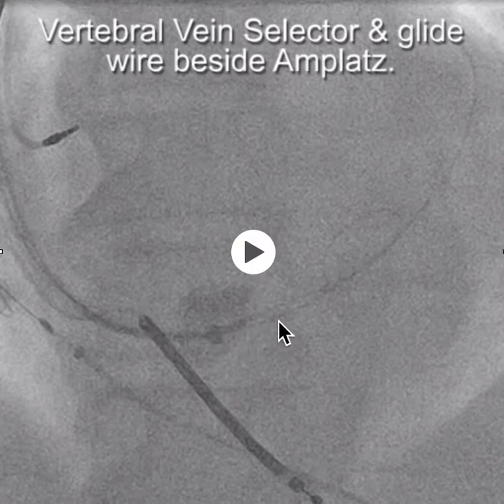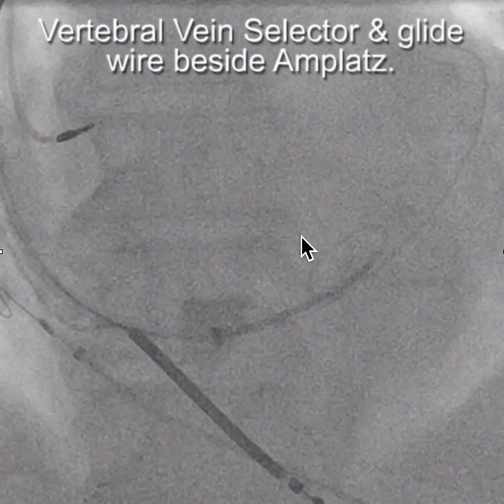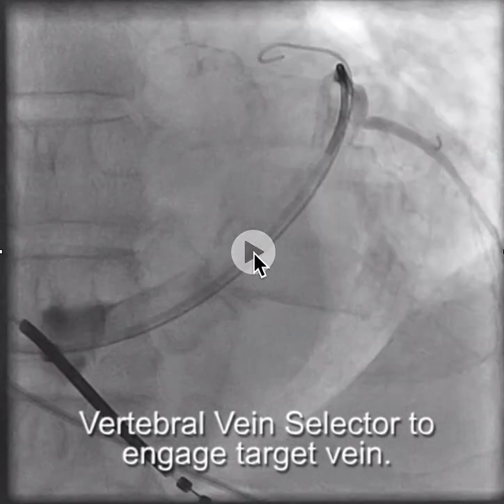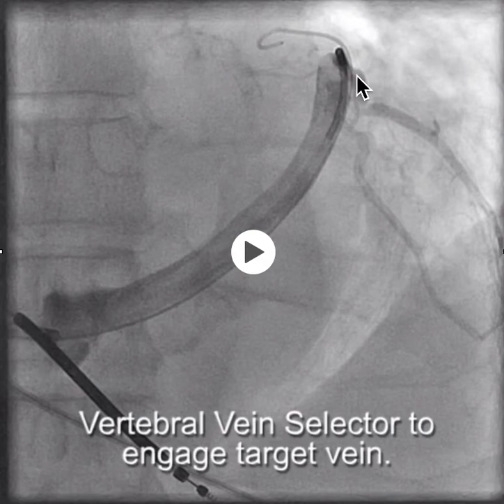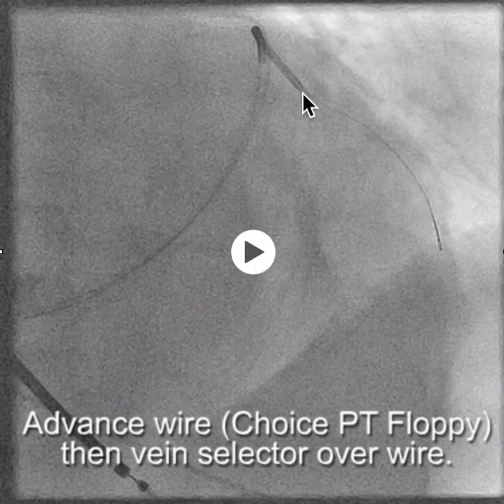At that point, we now want to put in a lead. So we're going to advance the vein selector beside the Amplatz wire over a glide wire, advancing the vein selector over the glide wire and into the true CS. From there, once we're in, we'll take the vein selector up to where the target branch we identified earlier, engage that branch with the vein selector, and confirm with a puff of contrast. All the while, the Amplatz wire is stabilizing your sheath. Advance a wire down through the vein selector, then advance the vein selector over the wire.